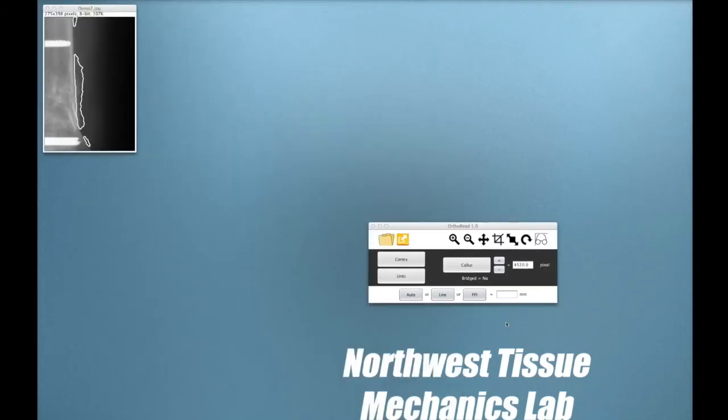Last, let's examine the PPI option. If the user knows the pixels per inch of the image, they can enter it and select the PPI option. OrthoRead then calculates the conversion factor accordingly and updates the results field to reflect the measurement in millimeters squared.